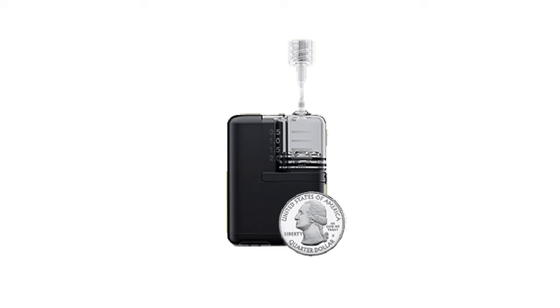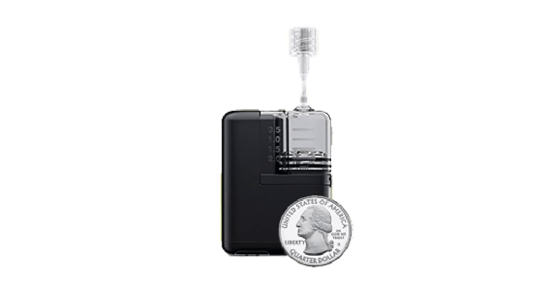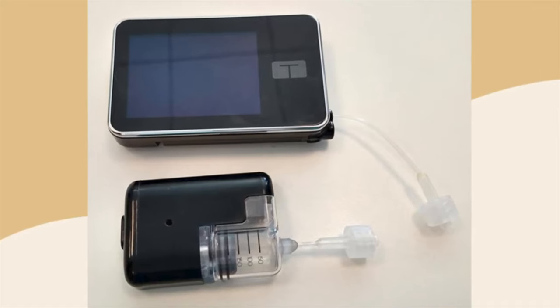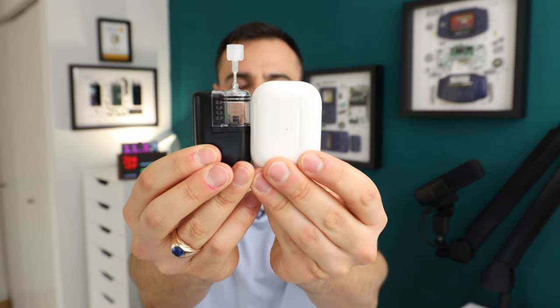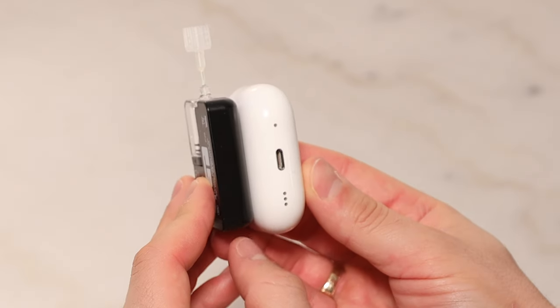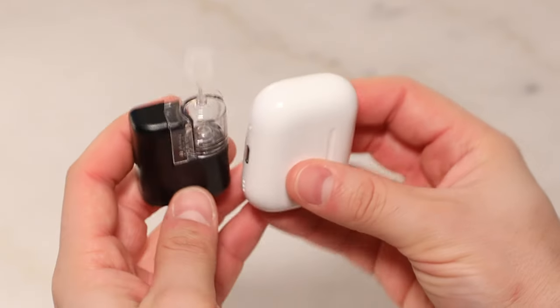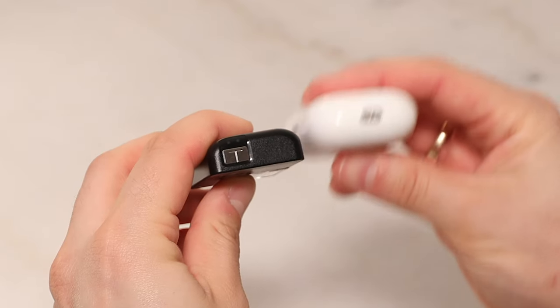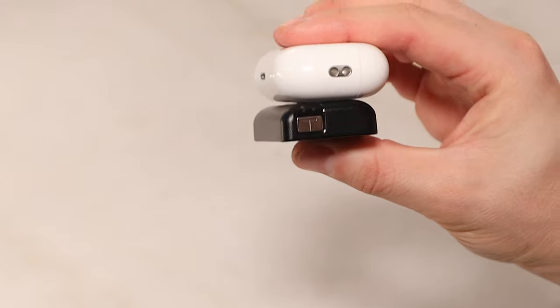Let's start with its size. As you can tell, this thing is small — it is half the size of the T-Slim X2. Just look at it next to an AirPods Pro case; all around it is smaller than that. I barely notice when an AirPods Pro case is in my pocket, so knowing this one you'd barely even feel is pretty nice for someone on a tubed pump.